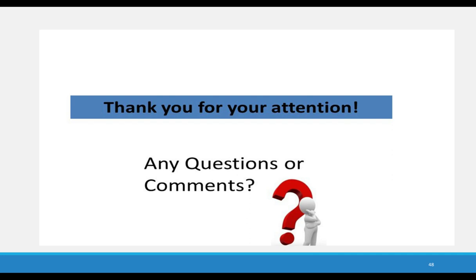Your first question is, what percentage of your stool orders are for all 4 panels versus single panels? That's a very interesting question. I have to say that most of our orders are not for all 4. Our most common order is for the Enteric Bacterial Pathogen Panel, and I would say the next most popular would be the Parasitology. We get very few requests currently for the extended panel.